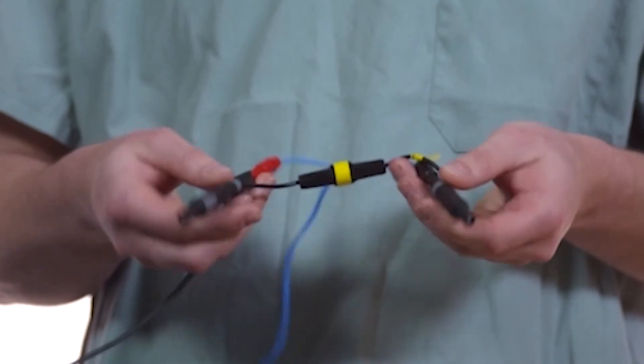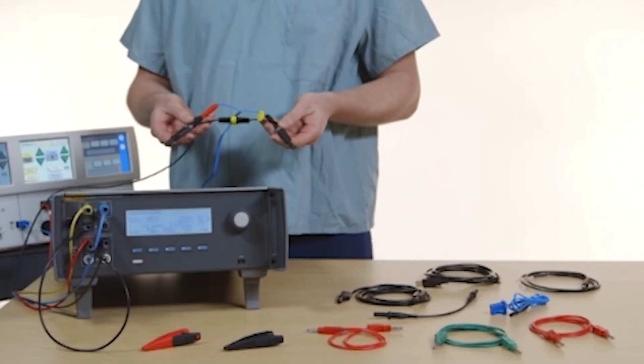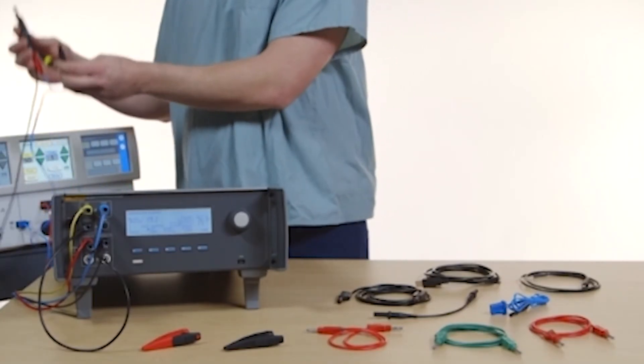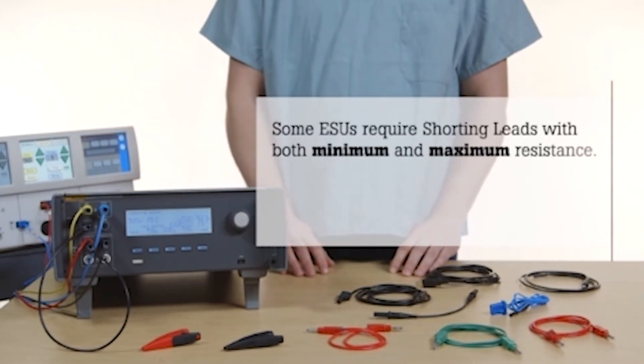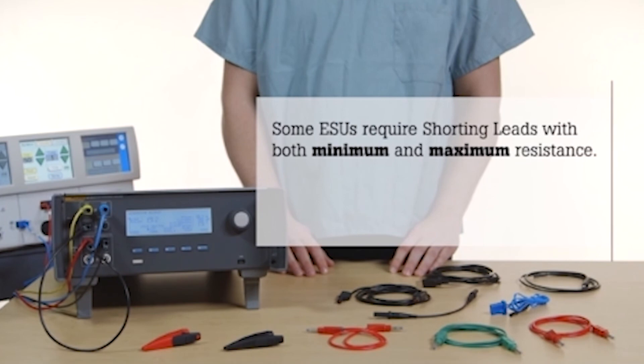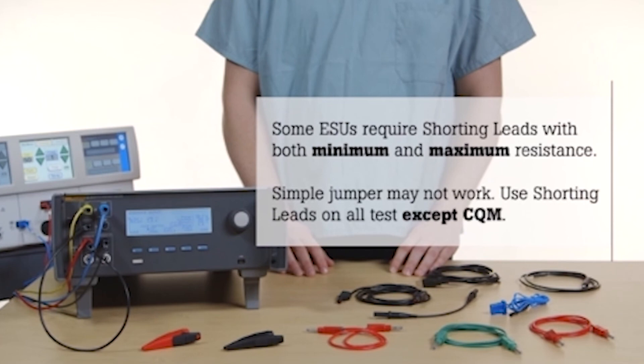The shorting leads, supplied with the QAES3, have a resistance that is sufficiently low to prevent an alarm on the ESU. Some ESUs, however, require the shorting lead to have a minimum resistance as well as a maximum resistance. A simple jump may not work. Use the shorting leads for all measurements except the CQM test.